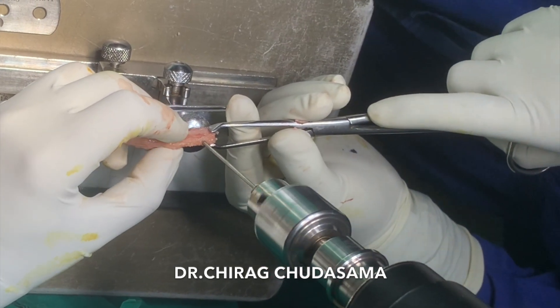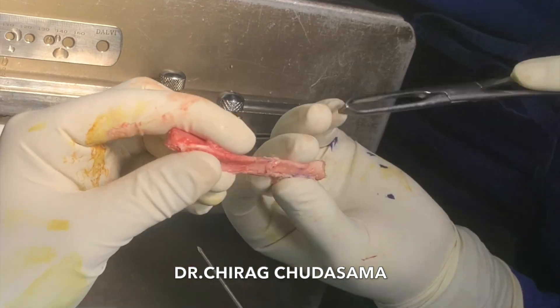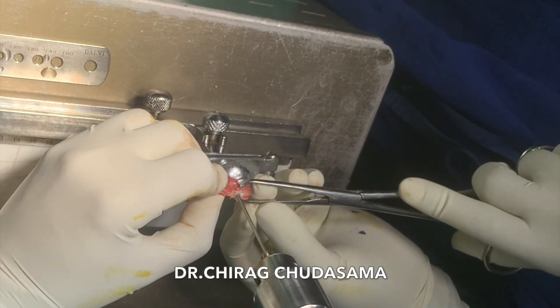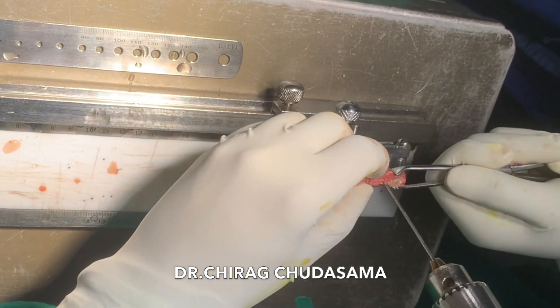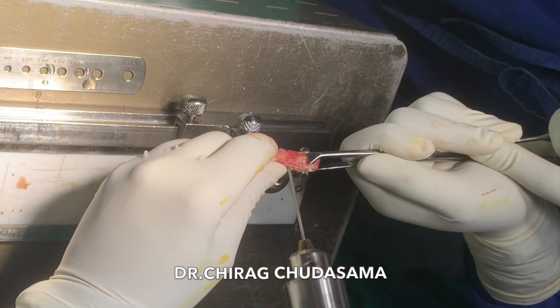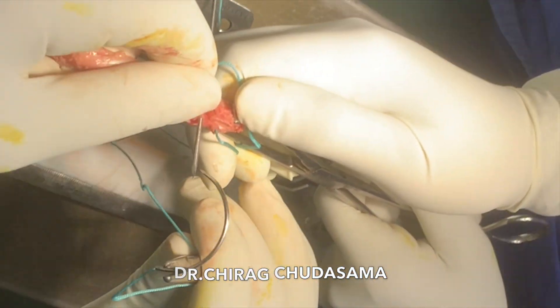Now you need to prepare this graft on the back table. You need to check the symmetry of the graft and whether it is passing through the desired graft sizer. Once it is properly shaped, you need to drill holes on both sides — one hole on the patellar bone plug side, which will go into the femur, and two holes on the tibial tuberosity side, which will go towards the tibia. I use number 5 Ethibond to prepare the bone-tendon graft. I do not use number 2 FiberWire in these cases, because those number 2 FiberWires are very sharp and their narrow diameter increases the chances of graft laceration, or the tibial or femoral bone plugs may shatter while pulling hard on the graft.